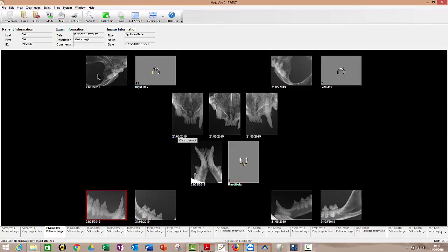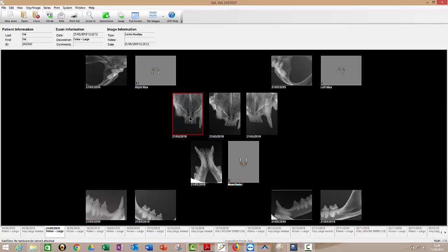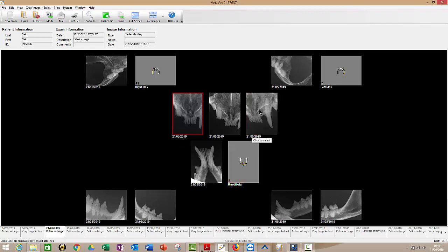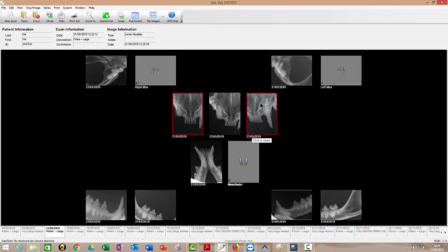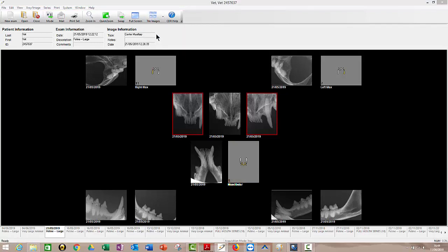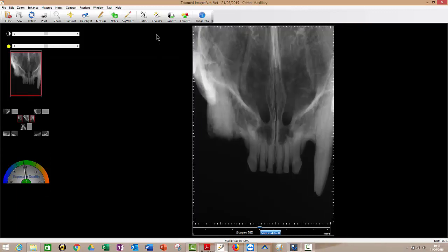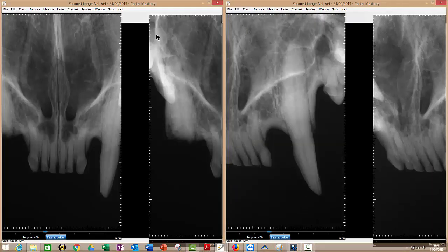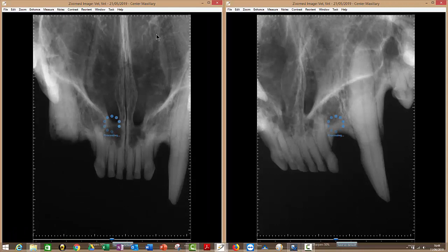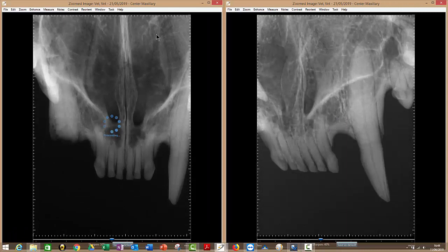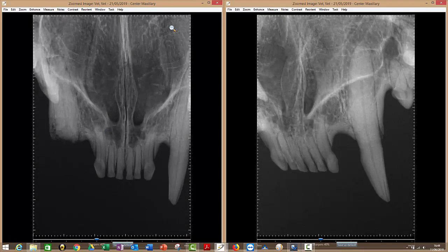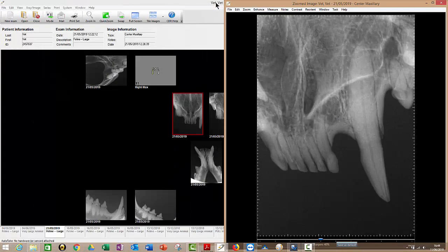So just a couple of things to show you here. You notice you've got different icons up here now. So say I wanted to look at both of these canines side by side. So I've taken all these images, but actually I just want to look at the two canines side by side. Now as I click on the boxes, it highlights them in red, but only one at a time. So if I hold down control, I can now select two boxes and then I can click on tile images, horizontal. And it will put those two side by side for me. Sometimes useful if you want to see if there's something going on on both sides in an animal. And then just close that down when you're ready.